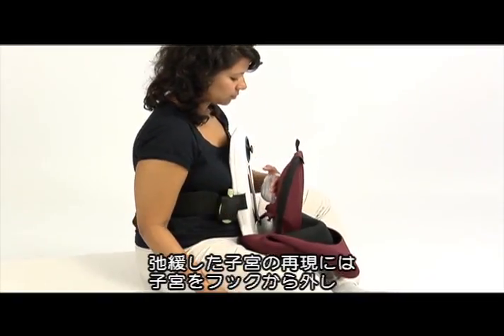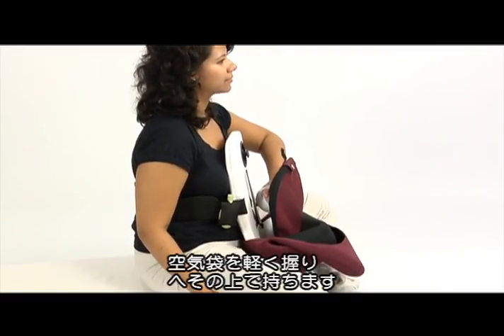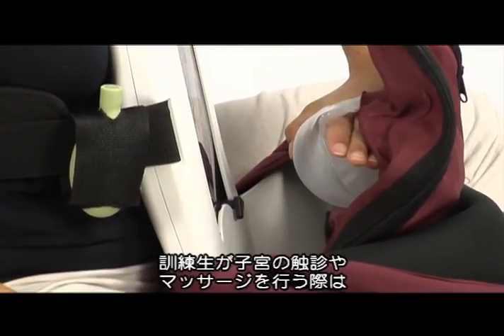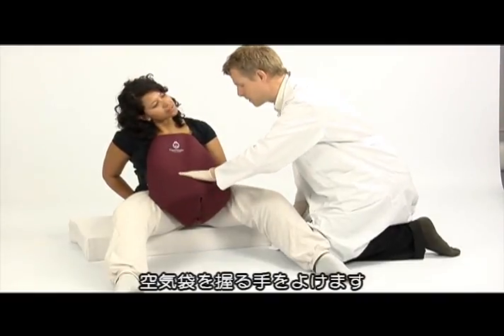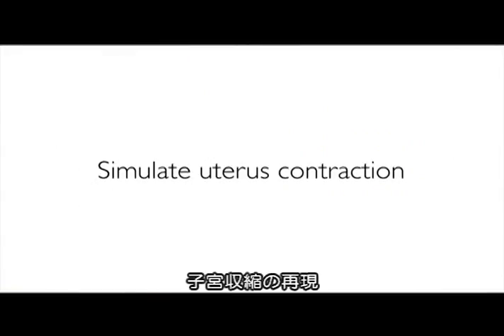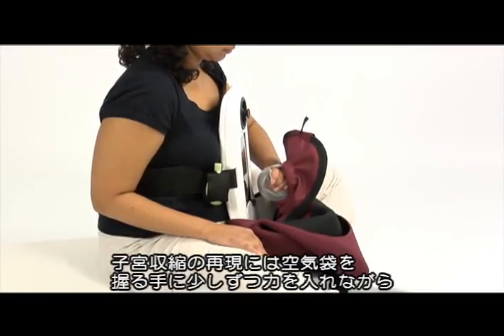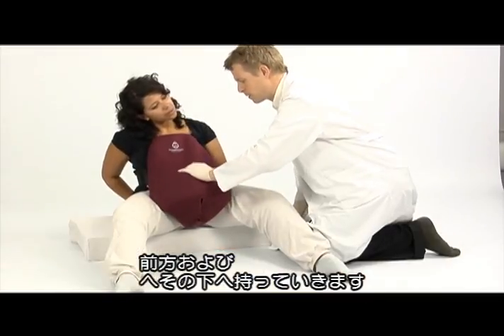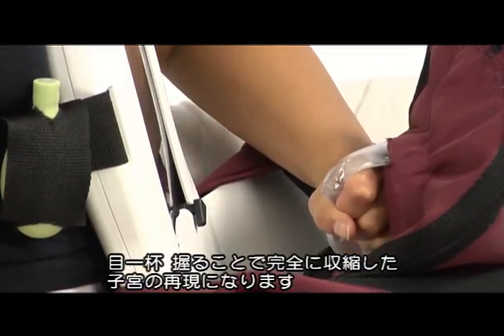Unhook the uterus. To simulate an atonic uterus, hold the uterus air reservoir with a relaxed hand and keep it above the navel. Twist your hand below the airbag and ensure that the student will only feel the soft, boggy uterus when palpating and massaging the uterus. To simulate uterus contraction, move the position of your hand forward against the stomach skin and below the navel while gradually squeezing the air reservoir more and more. Squeezing the air reservoir fully will simulate a fully contracted uterus.